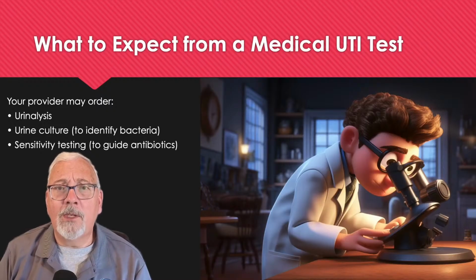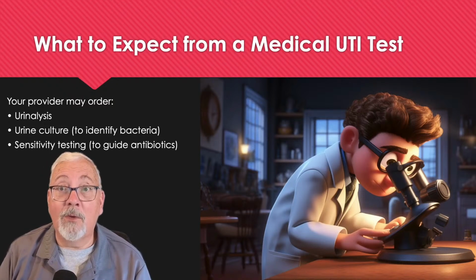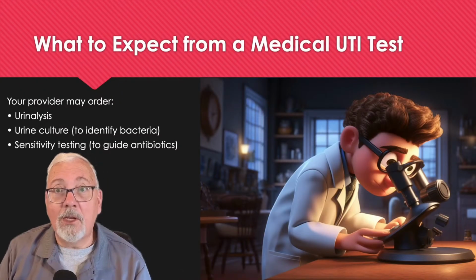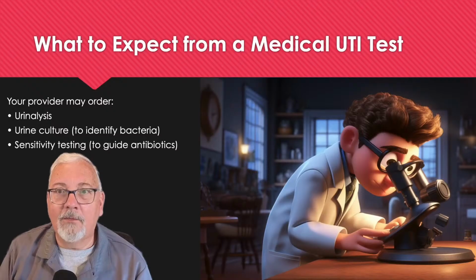If we do a test in our office and we see positive for leukocytes and nitrites, the first thing we're going to do is look under the microscope, because you want to see, are there actually bacteria? We can see bacteria with the microscope, often see them. And the leukocytes, those white cells, pretty easy to pick out too on the microscope. Pretty easy for me. I've been looking at urines for 40 years, but it's a pretty classical thing.